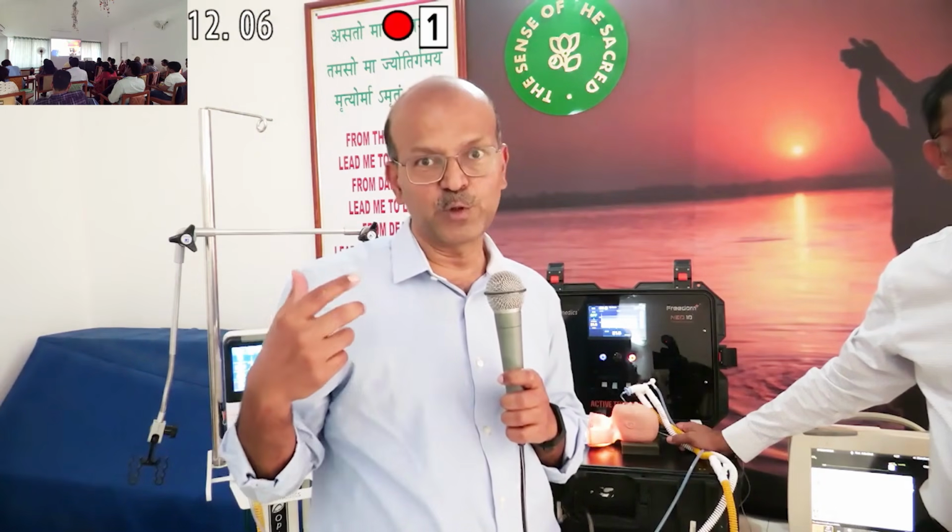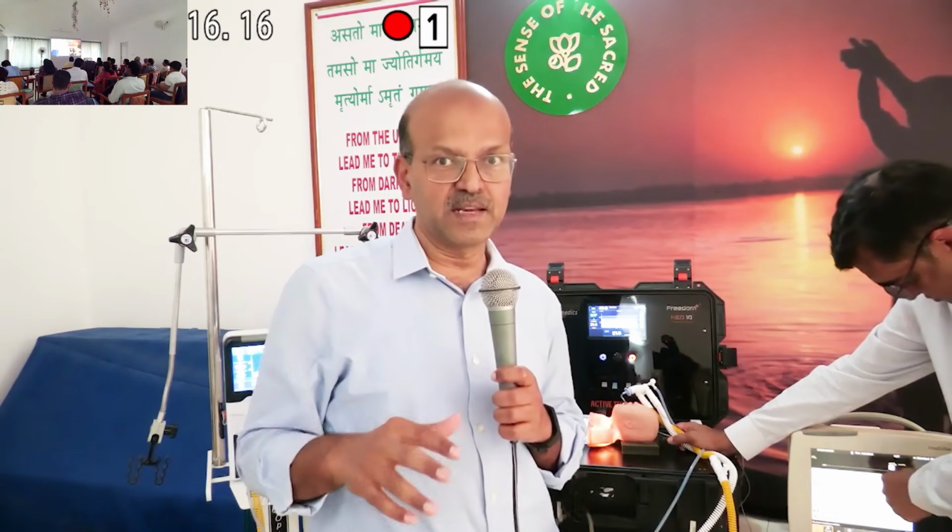A repeat X-ray is optional. You can watch the oxygen, and if you have the end-tidal CO2, we will discuss with Massimo next. If you have the end-tidal CO2 as well, you can review that to see a trend of whether the baby tolerates the clamping or not.